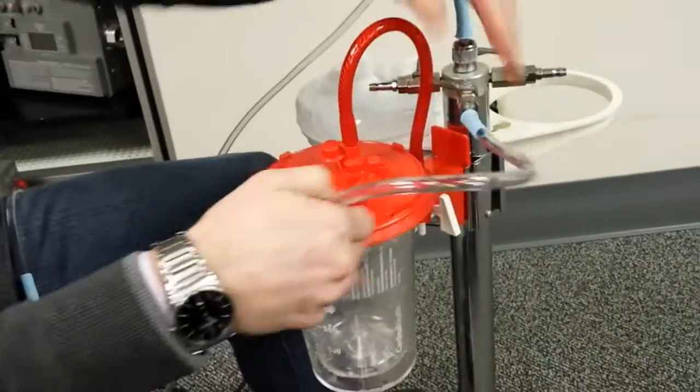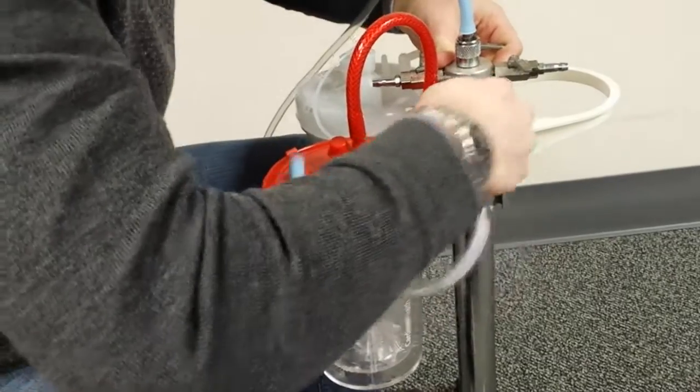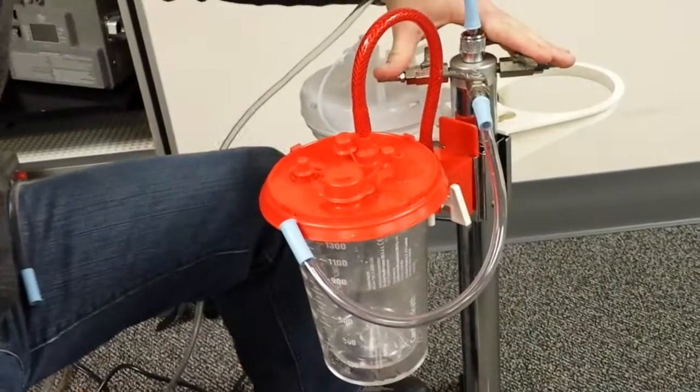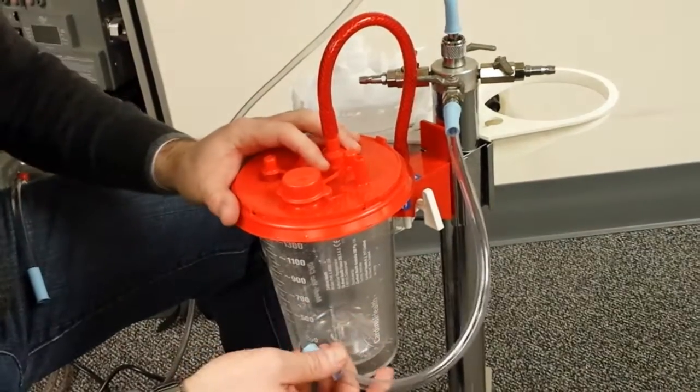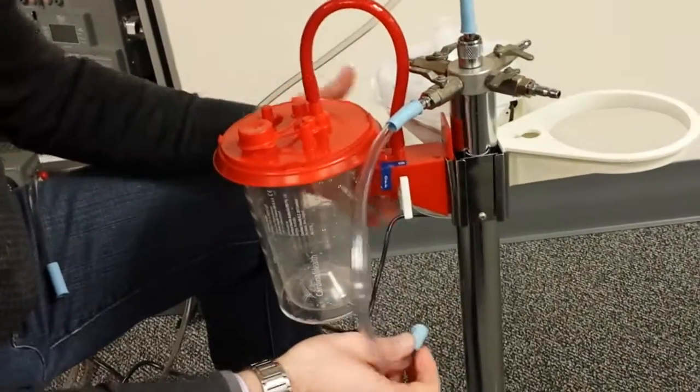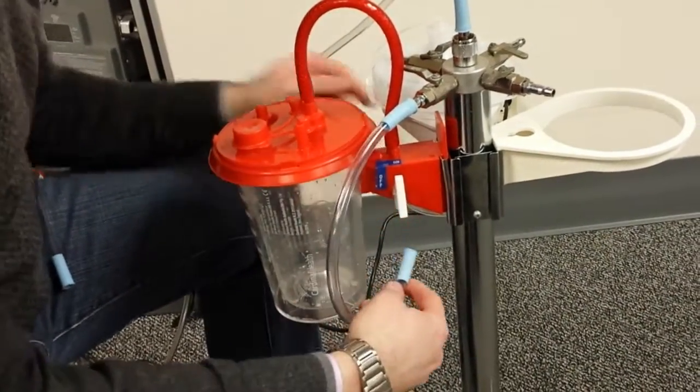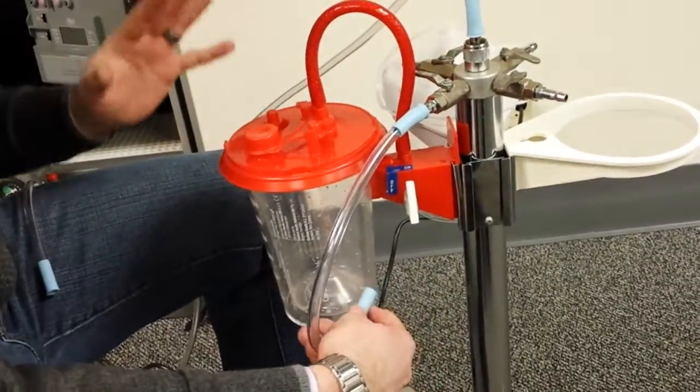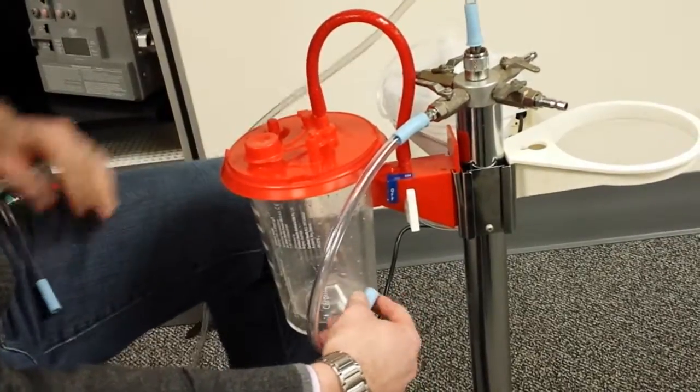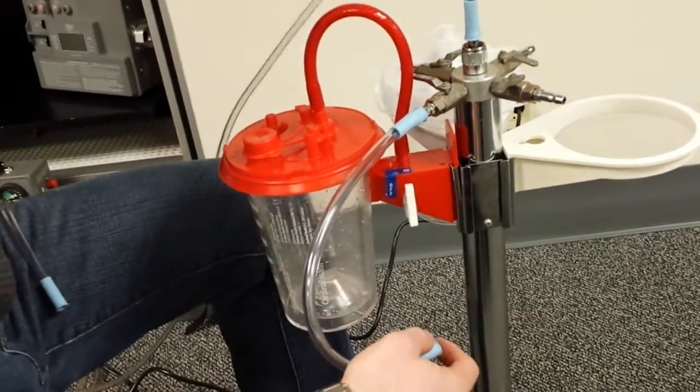Now, if you're using our canister stand, the one you have probably only has two connections on it. But that being said, it's hooked up the exact same way. What you're going to do if you want to hook up canisters in tandem, and have both canisters fill up from one suction tubing line, you're going to take your vacuum source.